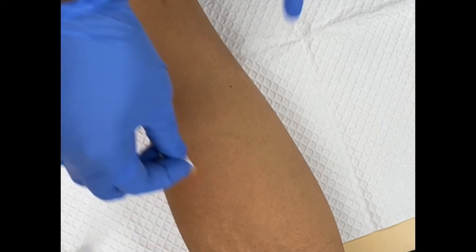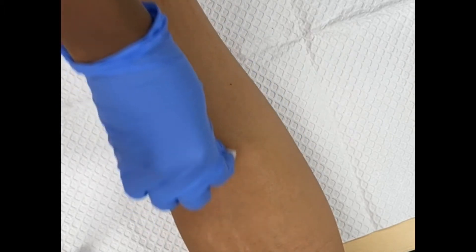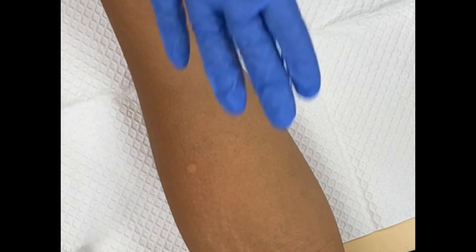We are going to first clean her arm. Remember when we are cleaning, we're cleaning from the inside out — going in this area here. Then we're going to let that dry.